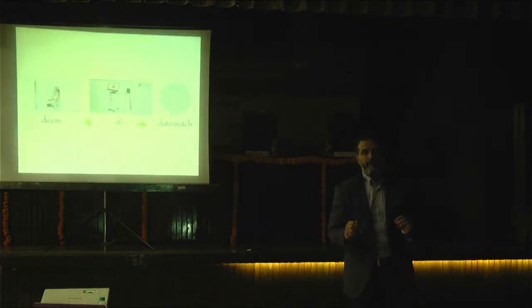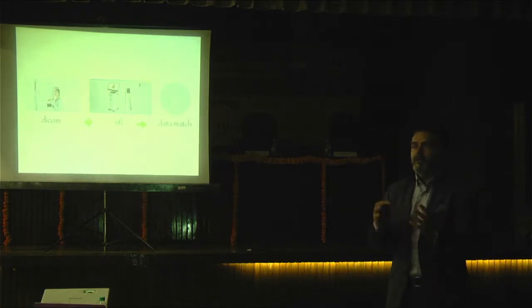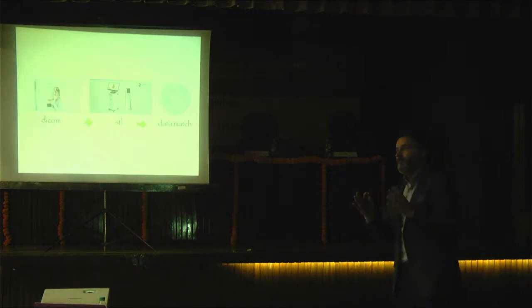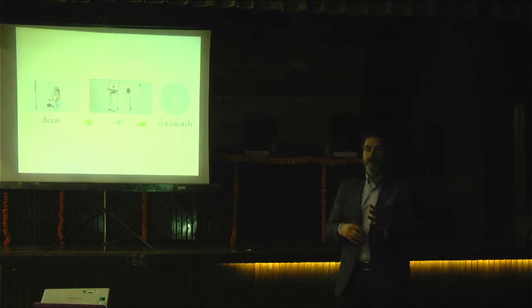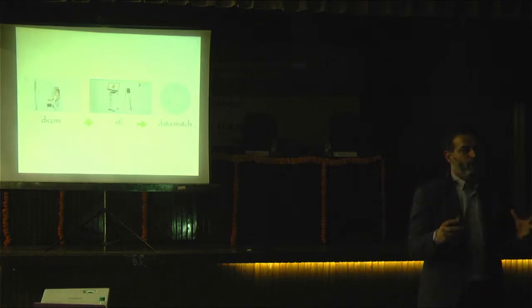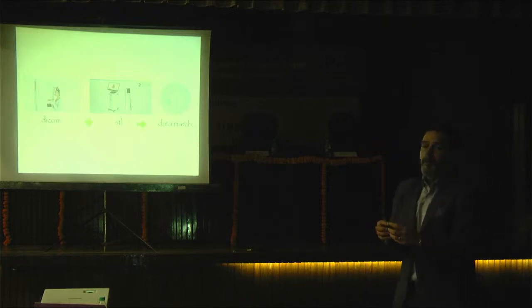The main topic, the summary of this presentation, is about matching the two files, which we call DICOM files, coming from the CBCT. It's just like that. You cut the head of the patient, and you take everything out, only the bone, okay? And we divide into parts, and we create numbers.